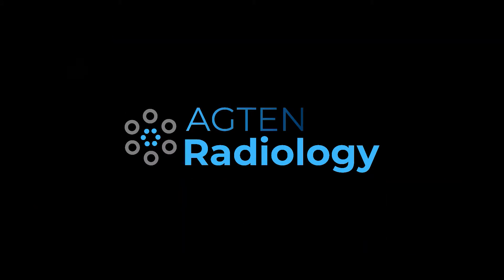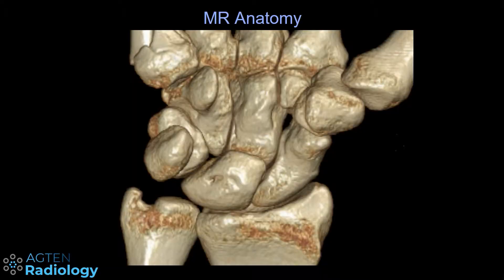In this video I talk about wrist ossicles and the different compartments in the wrist. You can have accessory ossicles in the wrist and they are less known than the accessory ossicles in the foot, for example.